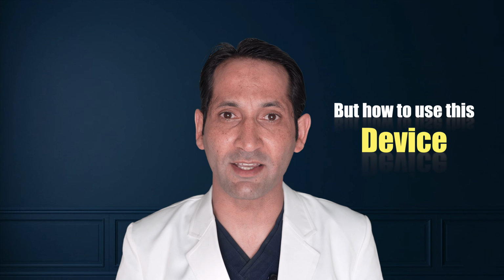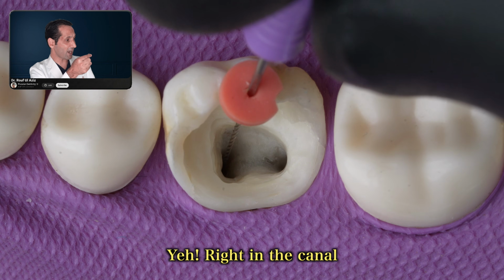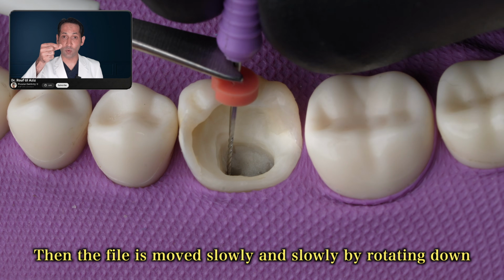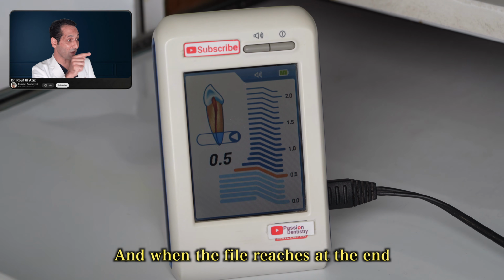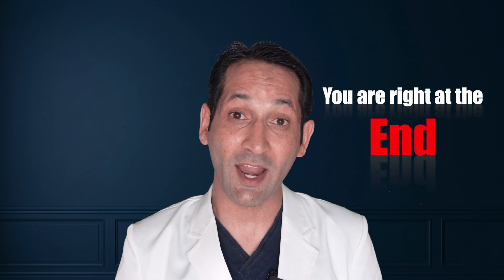But how to use this device? Actually, a small file that I need to place inside the canal. Yeah, right in the canal. And it's connected to the device. Then the file is moved slowly by rotating down. The device tracks the file. And when the file is at the end, yeah, this is the end. The device signals stop, you're right at the end.